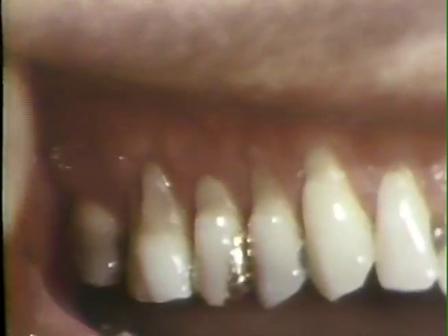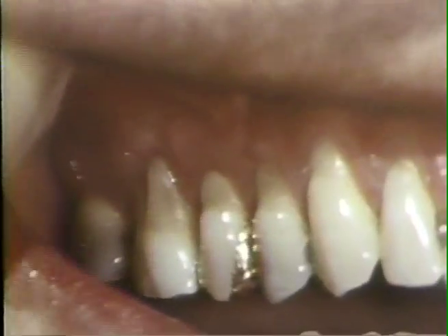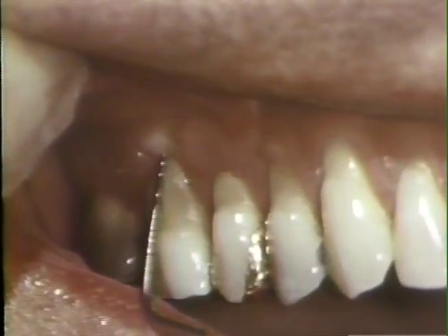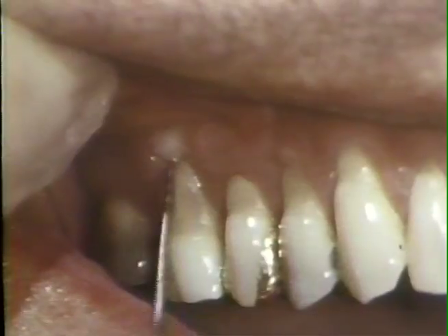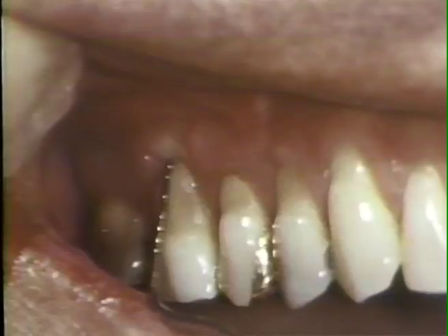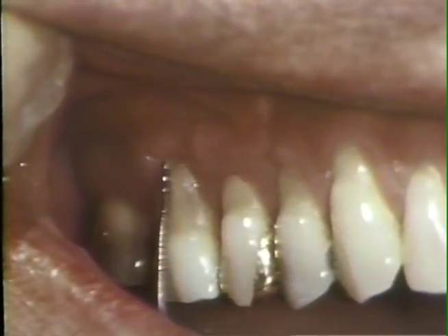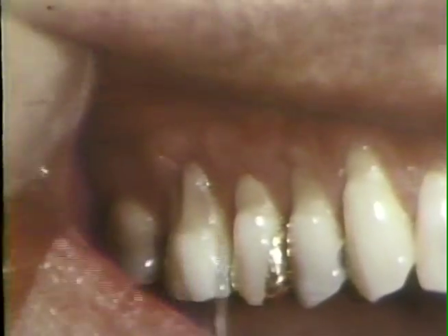The objective of this laterally positioned flap procedure is to restore gingiva to the surface of a tooth where it has been lost by periodontal disease. The operative site 5 weeks later shows that there is gingiva present on the mesial buccal root of the first molar. The donor site on the second premolar has healed well. Probing demonstrates that there is a shallow sulcus of 1 millimeter at the donor site and 1 1/2 millimeters of depth on the mesial root of the first molar. Muscle pulling shows the cuff of gingiva is not retracted from the tooth.